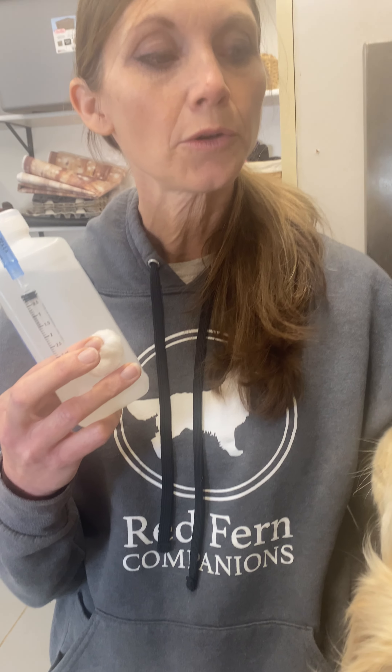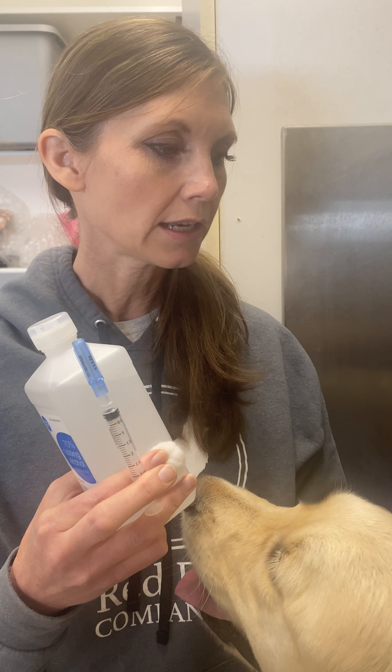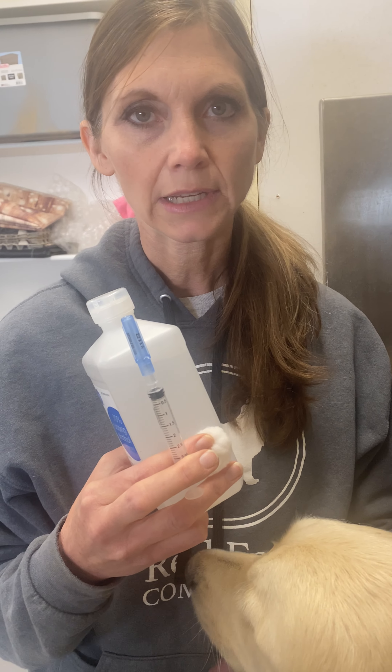After you draw the blood, you will want to put it in the refrigerator to keep it cold until you get it to the place where you're taking it, if you're not going to be using it immediately.